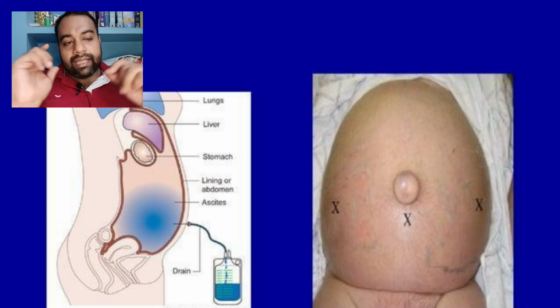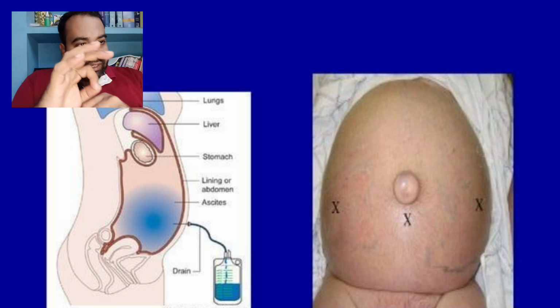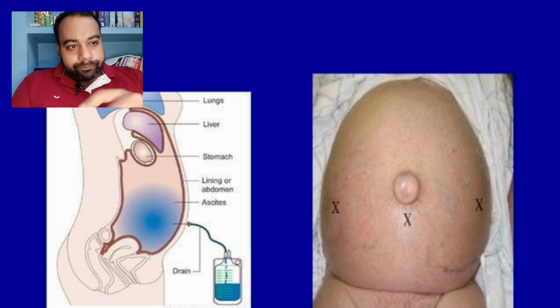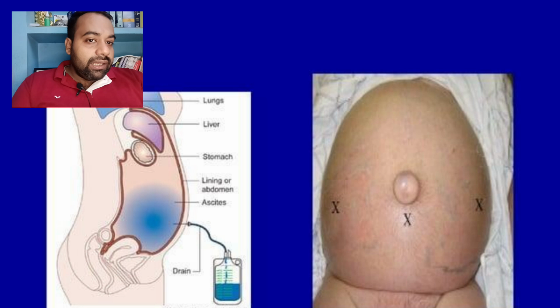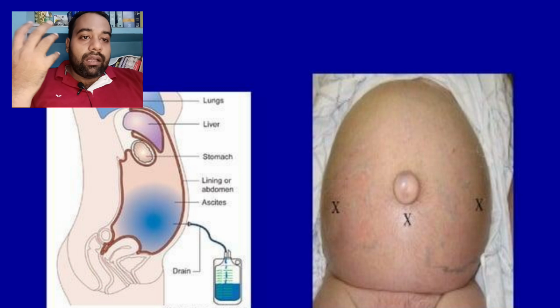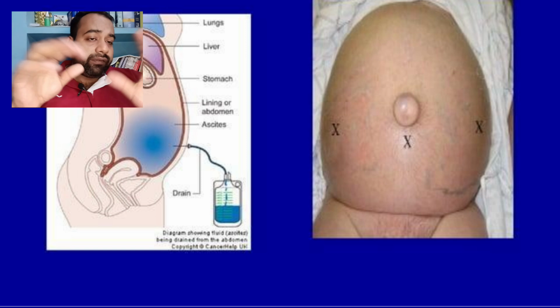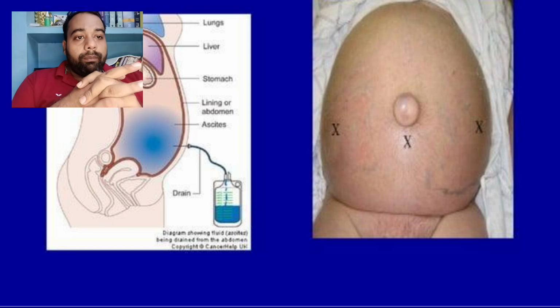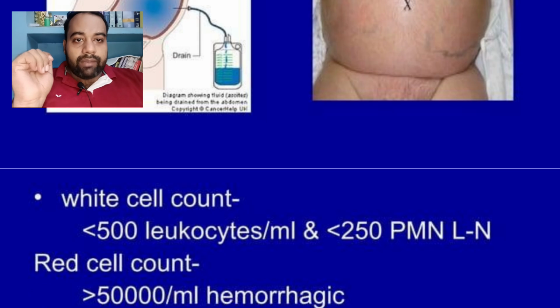We usually take a wide bore cannula, or you can easily use a wide bore IV cannula in some cases, to get into the place for the paracentesis. And this right sided image typically shows umbilical eversion with superficial venous prominence, and obviously there is tense ascites that you can easily appreciate.